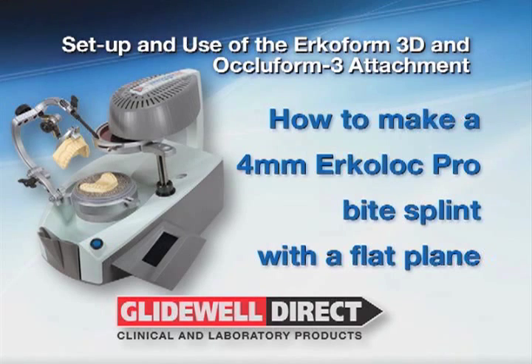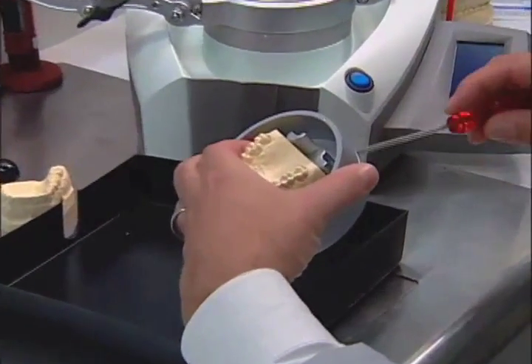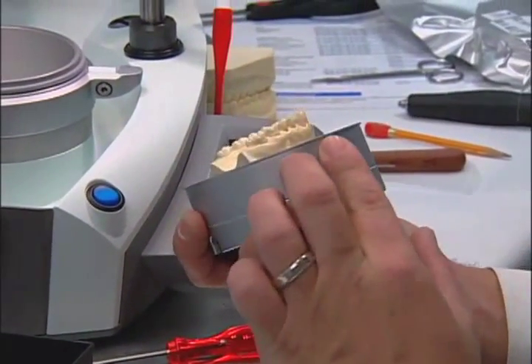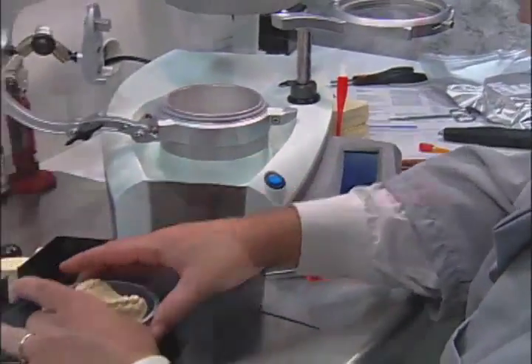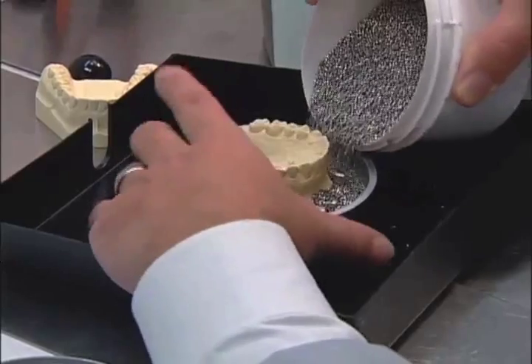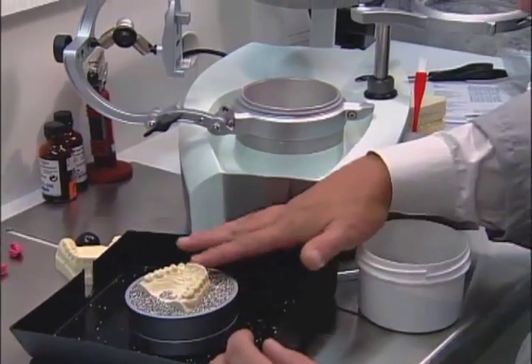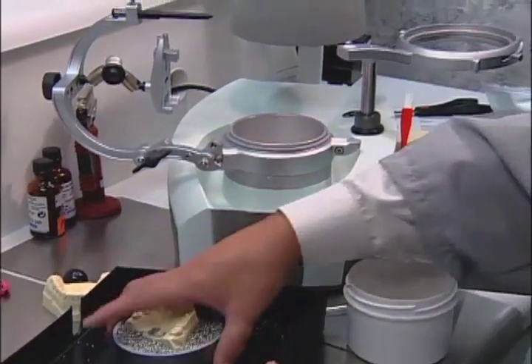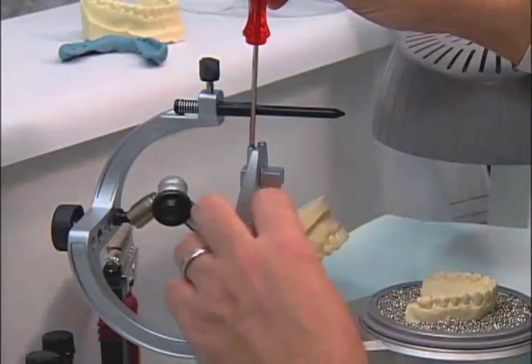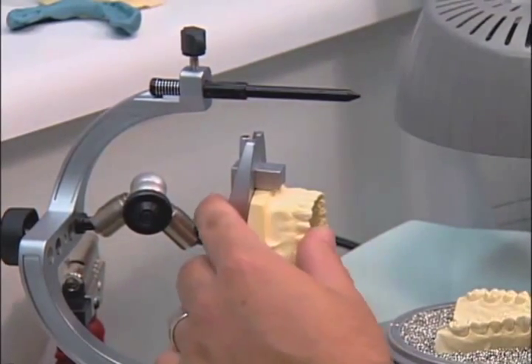To make a 4 mm ErkiLok Pro Bite Splint, begin by placing the upper model into the model container and tightening the Allen screw. All thermoformed areas should be above the model container. Fill the model container with steel granules, being sure to fill in any open areas and pack firmly. Then place the model container into the 3D thermoforming chamber and align the dots. Loosen the joint screw on the Ocloform 3 and place the opposing model, then tighten the Allen screw completely. Be sure the joint screw is tightened as shown.